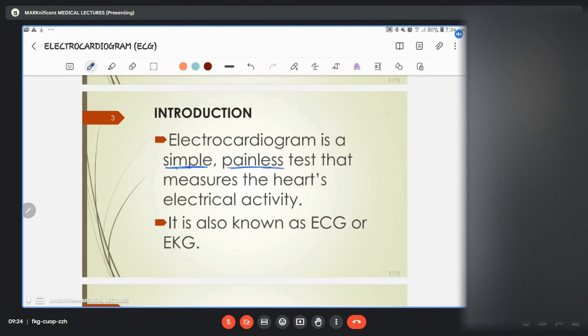We'd use one of us as the patient, in quotes. We'd place those leads, the chest leads and the hand leads and all of those things. That's where the ECG tracings are gotten from, and then you see it calibrated on the graph.